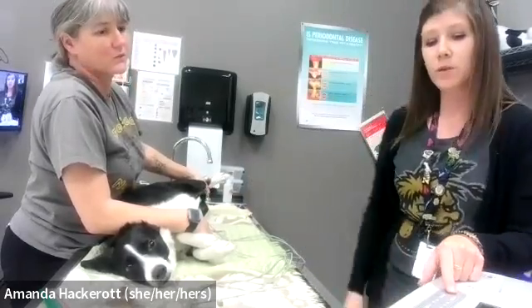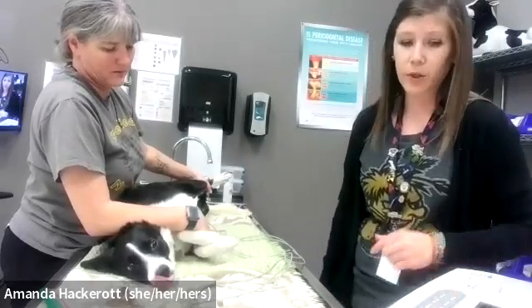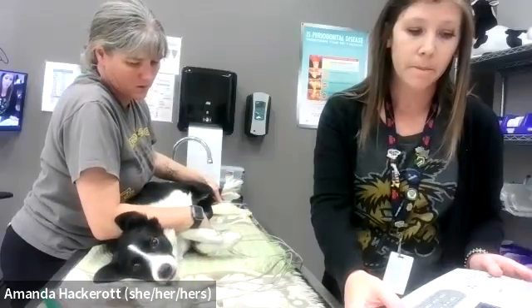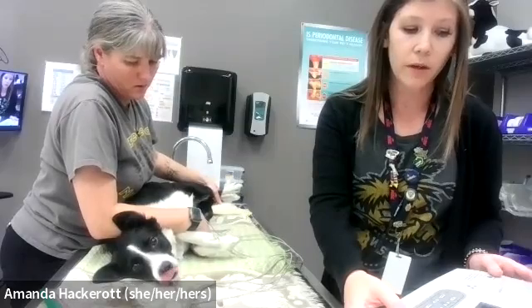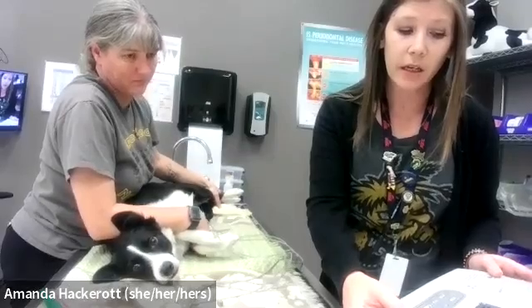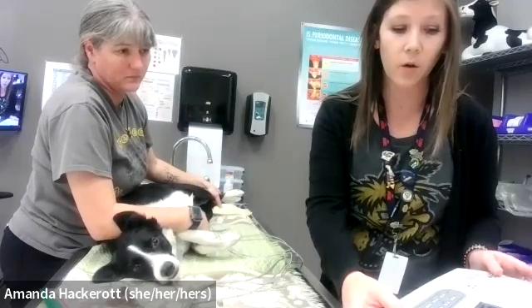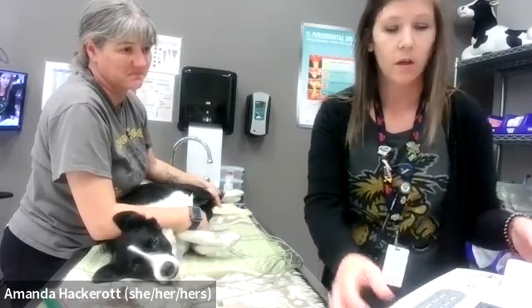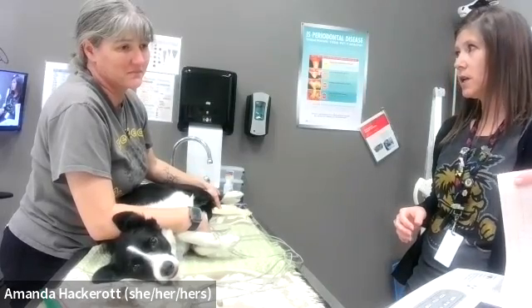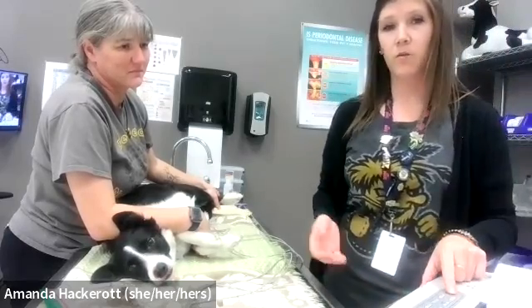Then we have our EKG machine. We're going to turn it on, and once it's on we are going to push start, and that's going to run a strip of paper for us. It is important that you remain calm and quiet as you're restraining and running this, in order to make sure your patient stays calm and quiet. You can see we have our strip that's starting to come out for the EKG for our little friend cat. And that is how you run an EKG.